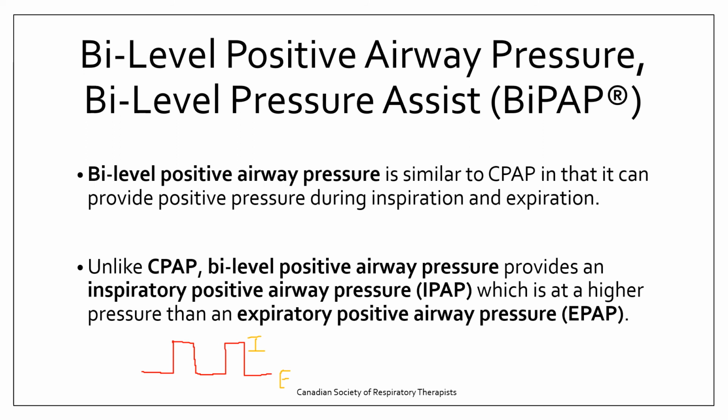If I was to increase my PEEP in this situation, if I'm to increase my EPAP, well, my IPAP is still staying the same at 15. I haven't changed that. So now my EPAP is up to 10, my IPAP is at 15.